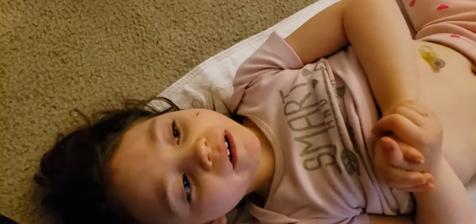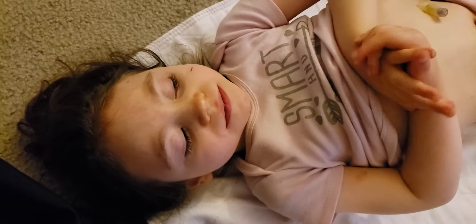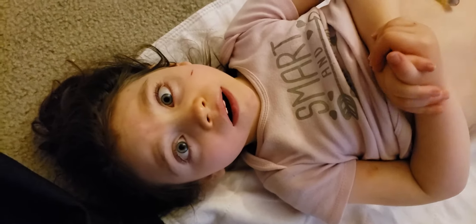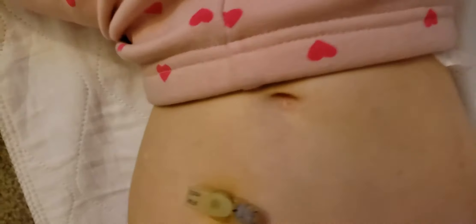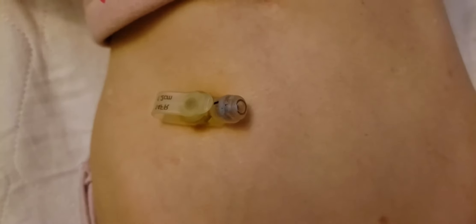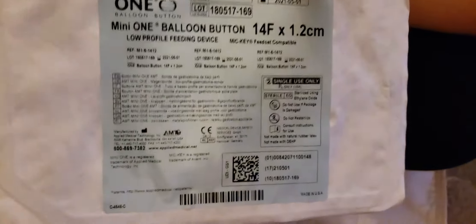This is Annabella, five years of age, and we are going to change her g-tube. This is a video about changing it — we change it every three to six months, this one needs to get changed, and we're going to change it with the mini one. This is the size she's always had, the same size since about three or four months of age.